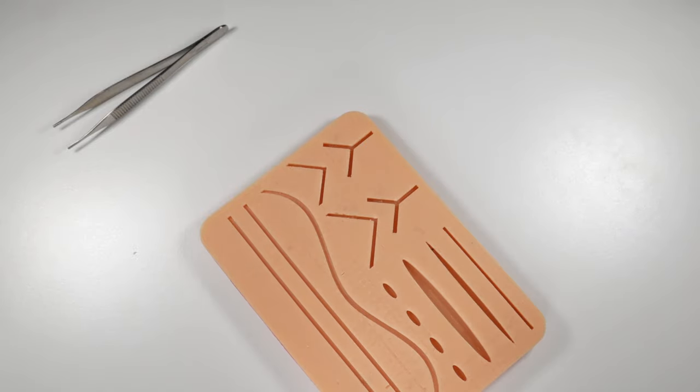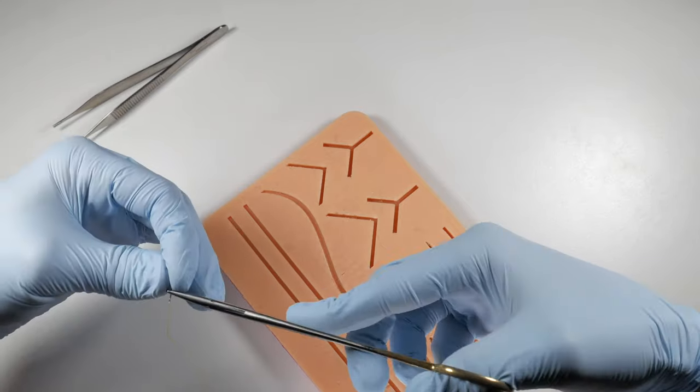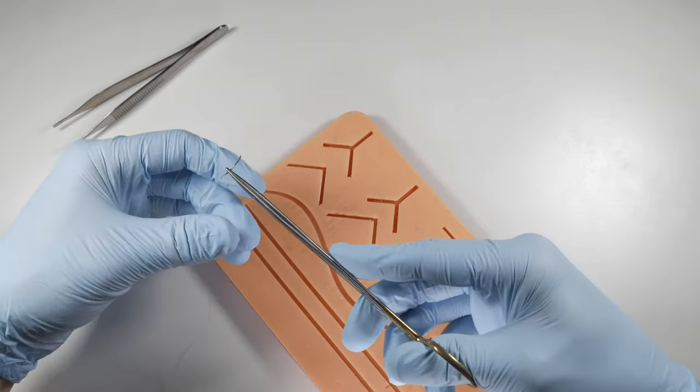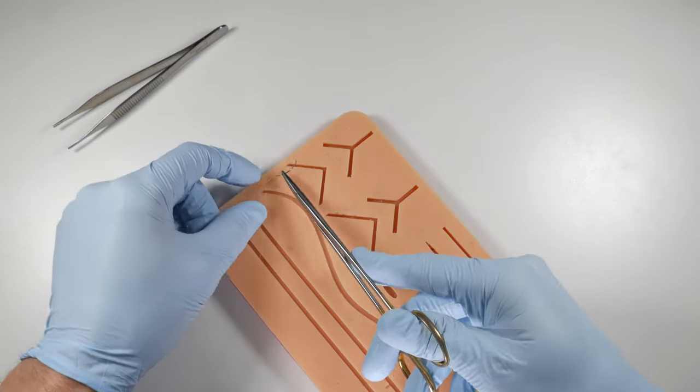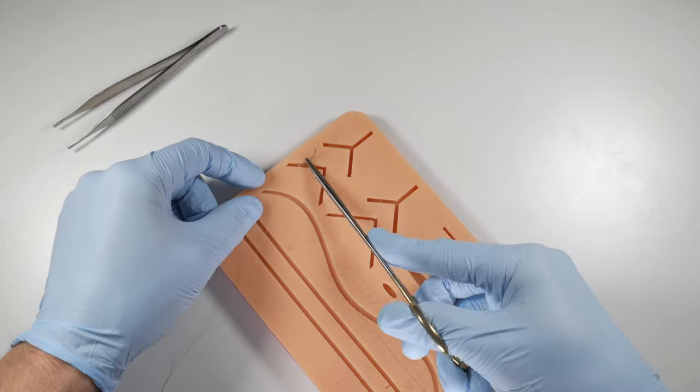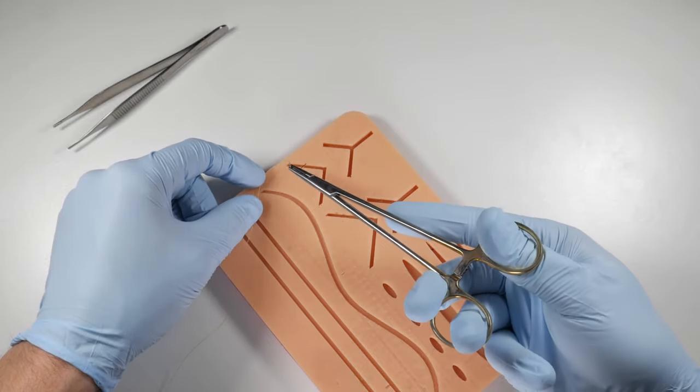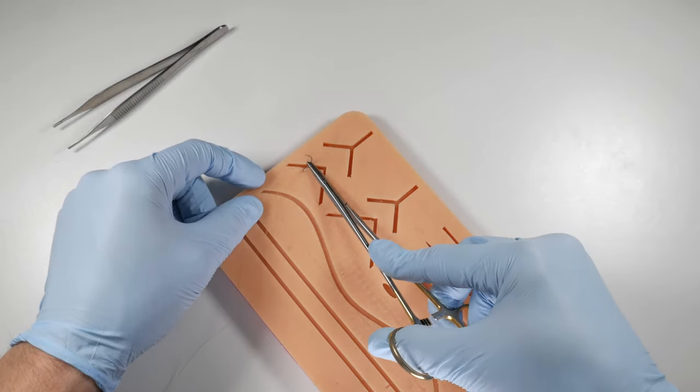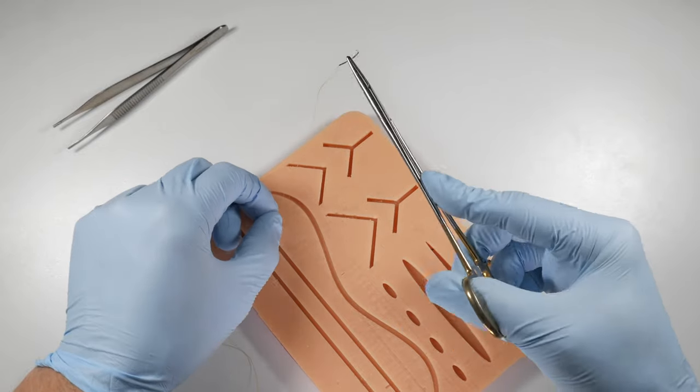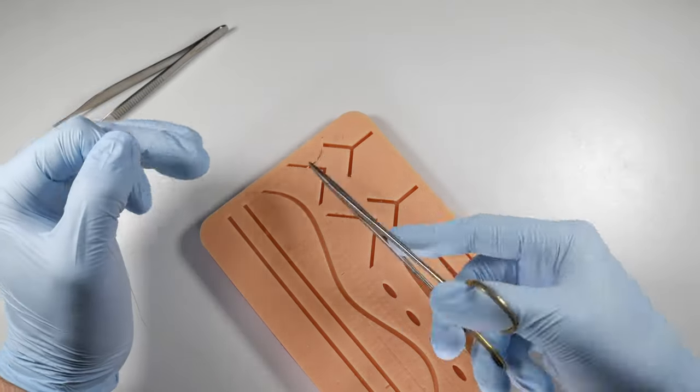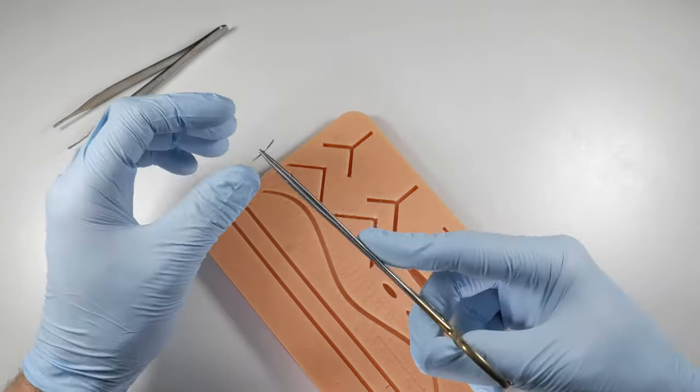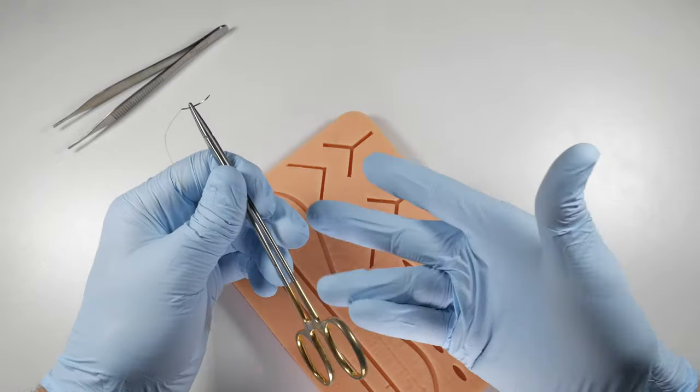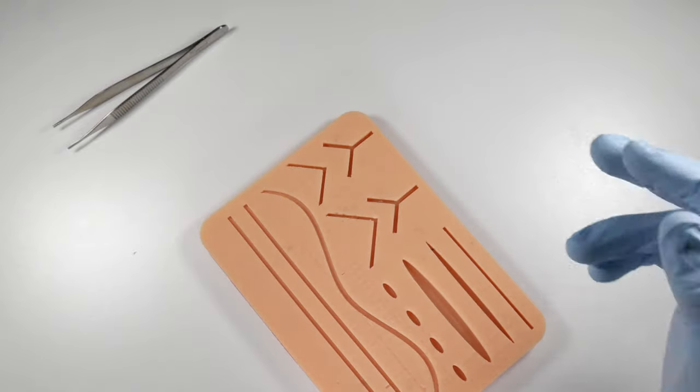Sometimes for whatever reason, and I'm not sure why this is, but it might just be the way that it works with your movements. For me anyways, when I'm passing through the interproximal area of the teeth, backhanded movements seem to be a lot easier for me to scoop in and get through the interproximal region. See what you can do. You might need a forehand movement as well. Either way is going to work. Backhand for me seems to feel more natural and seems to glide through a little bit more easily.